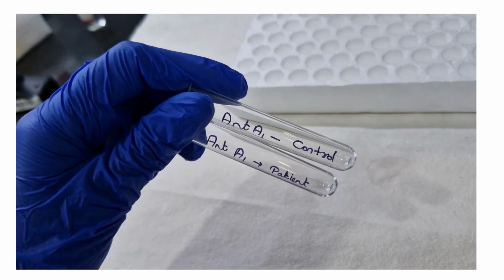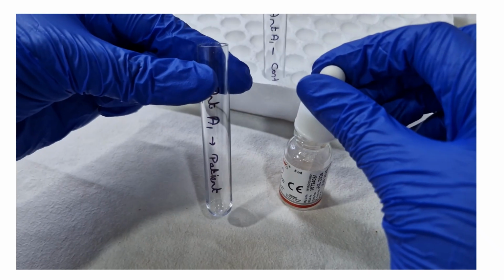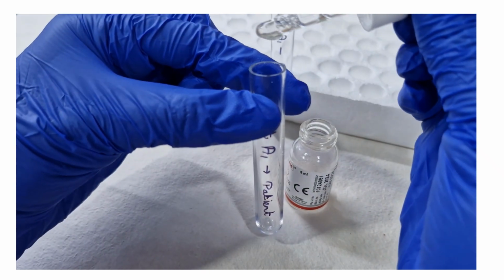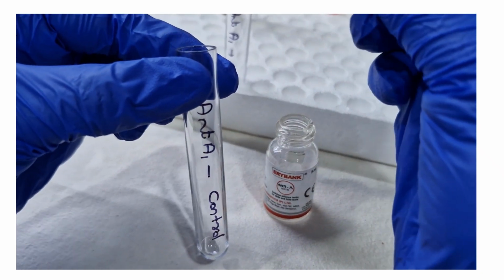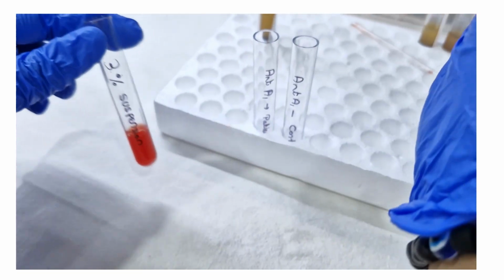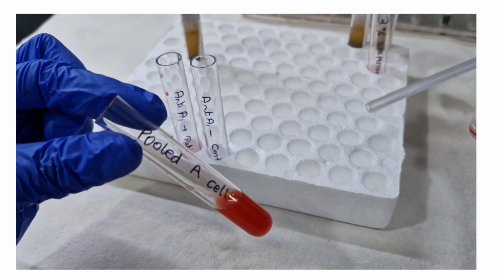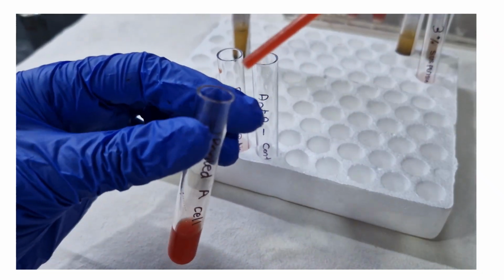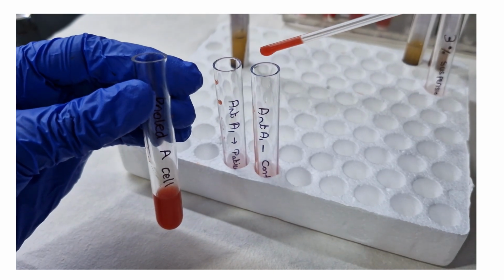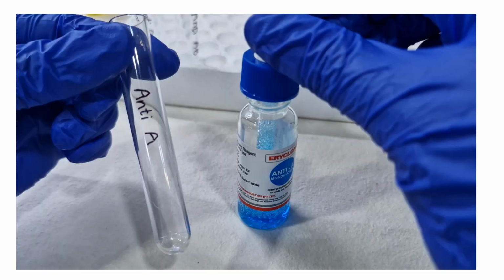Additionally, we have taken 2 tubes labeled anti-A1 patient and anti-A1 control. To both the tubes, we will add 1 drop of anti-A1 lectin. In patient's tube, we add 1 drop of anti-A1 lectin and 3% red cell suspension of patient, whereas in control tube, we will add pooled A cells. Gently shake the tubes to mix the contents.